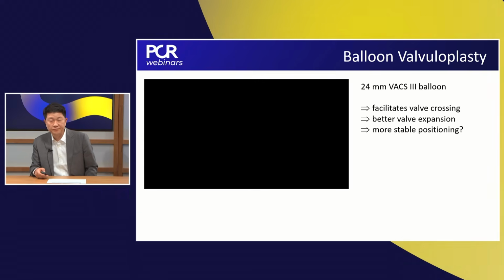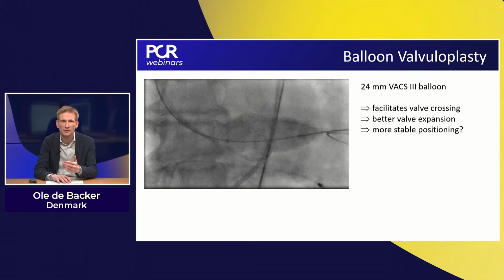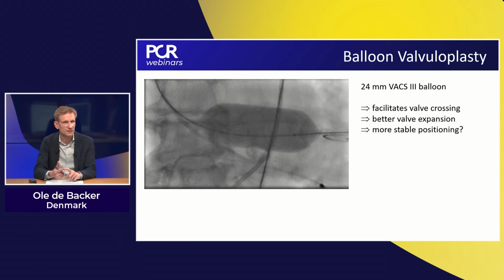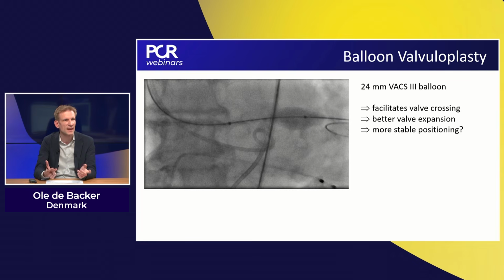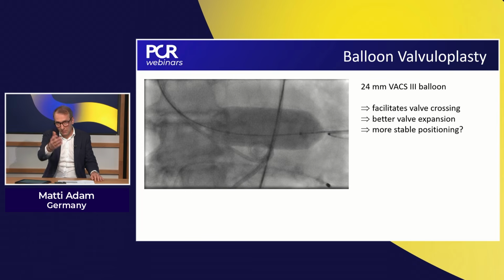Many people, if they do balloon expandable valves, don't have the habit to predilate, but if there's any anatomy, either bicuspid or severely calcified or horizontal aorta, I do predilatation for sure. It helps you with everything, with valve positioning. Like your slide is perfect.